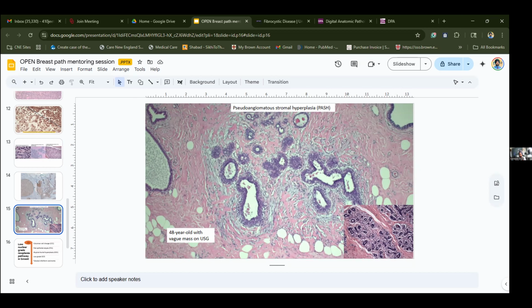I would spend a lot of time on those in the beginning. You want to learn what normal breast tissue looks like, and then look at the slides of abnormal and see how it is different. Is there an increase in cellularity in the stroma? Do the cells inside the ducts look different? Is the lining a little different? Is it apocrine? And then you record it and put it together.